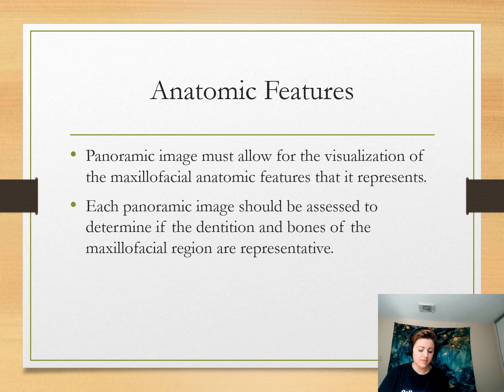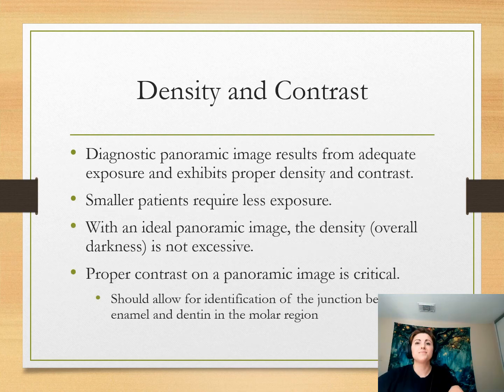It also says 22-16. Yes, there it is. I like 22-15 at the bottom of 251 because it has a little bit of a sharp smile line, but that's okay because it shows you really good density and contrast. Figure 22-16 is overexposed. It means it's too dark and we can't see the differences of the teeth, and we'll talk about that in a second too.